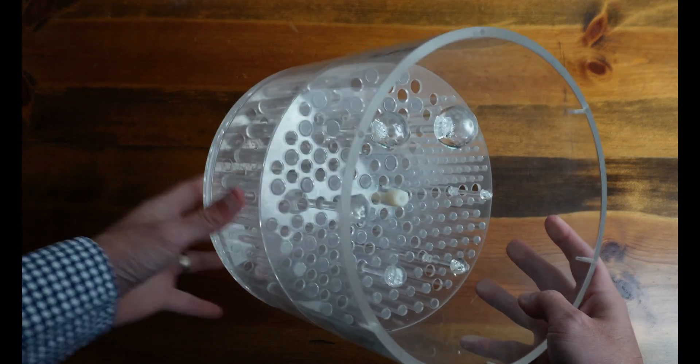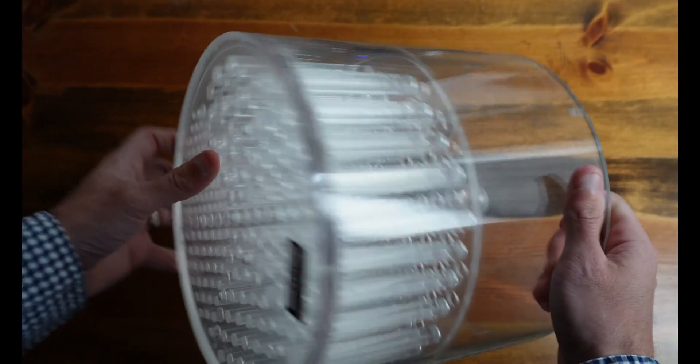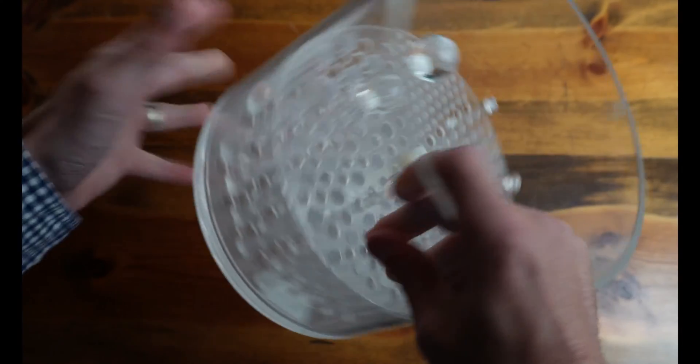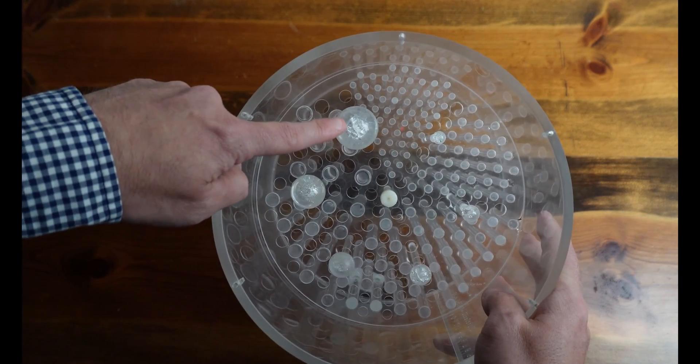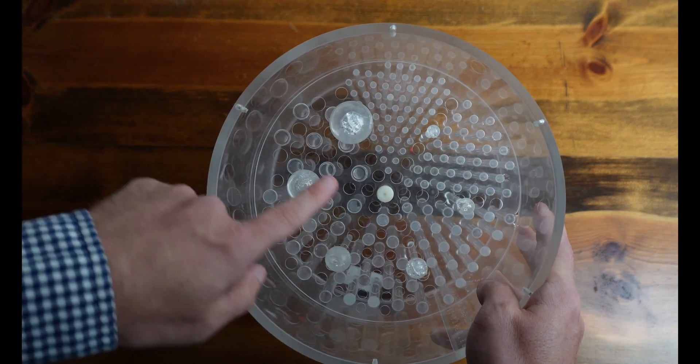So now we have all of our spheres are placed in the Phantom. They're screwed in through the threads at the bottom of the Phantom. And we have each sphere is aligned with the corresponding rod section going from largest to smallest.